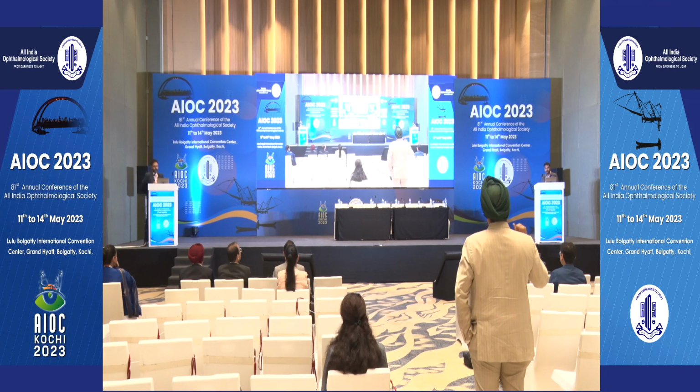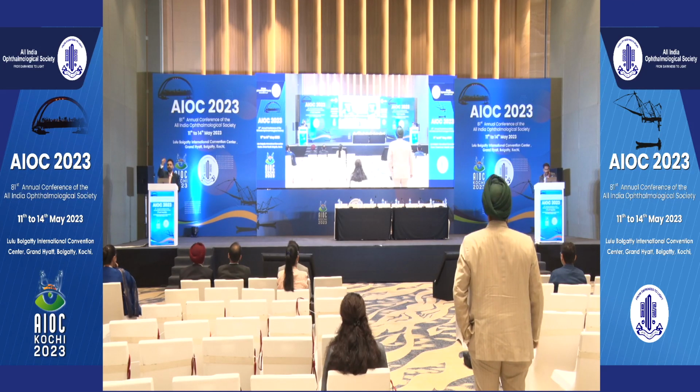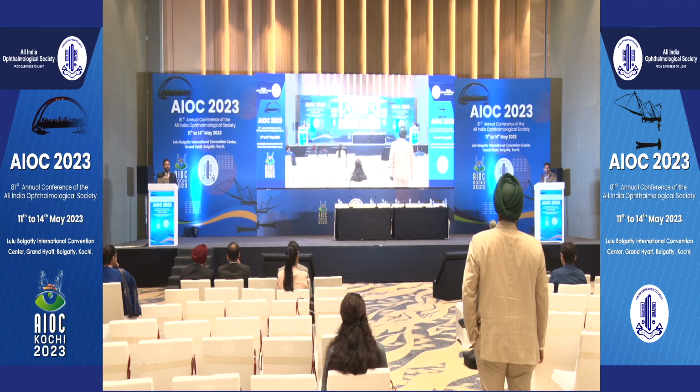Basaf, if you were to take home something from this, do you think the location from the fovea would be a factor in choosing when you want to do it and when not? Because this was relatively, I think, within 500 microns from the foveal center where you chose to laser. The simple thing about the fovea is, if you divide the disc into 3 parts, the upper one third, middle one third, lower one third, the fovea is in the lower one third. It's common sense. We have to avoid that area.